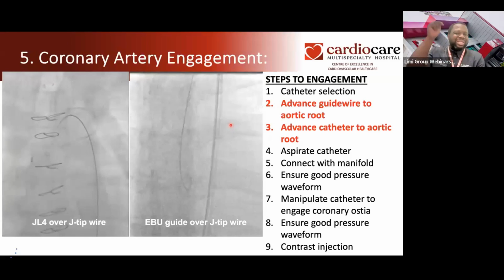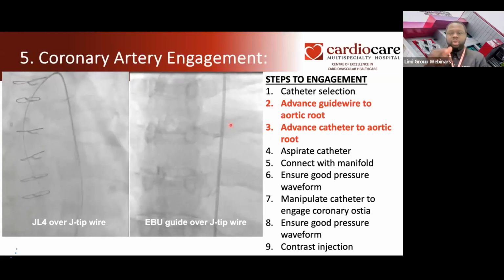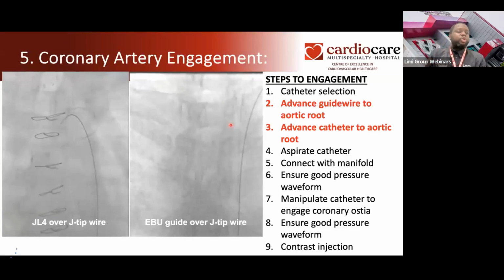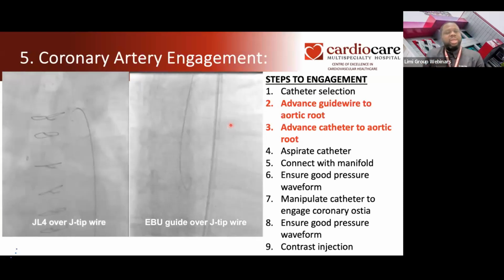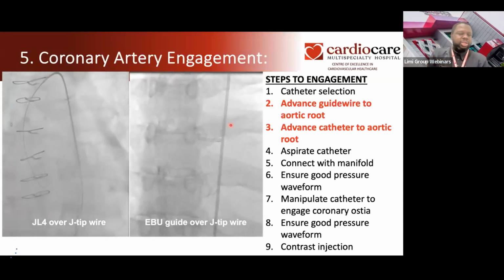You need to know the instantaneous blood pressure while you are doing what you are doing. I think there's a slide here. I'll just check. While you are doing what you are doing, that helps you to know when a problem is happening. So anybody that is doing these things without those things normally puts the patient at severe risk. So that intra-arterial blood pressure is critical in this.